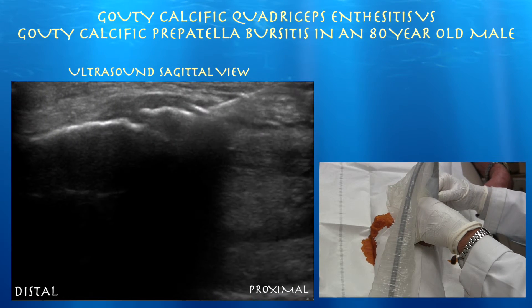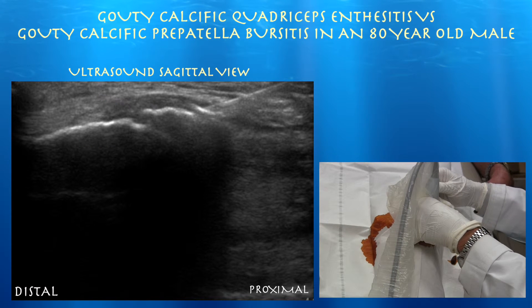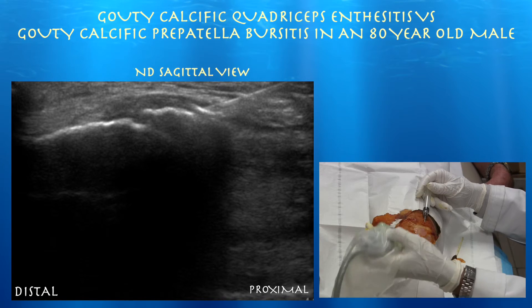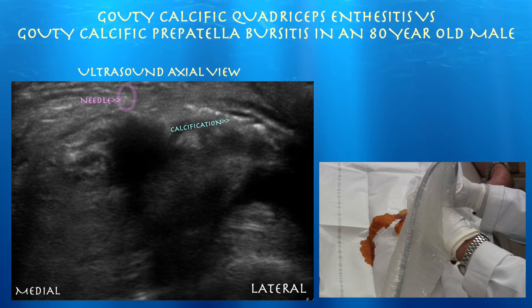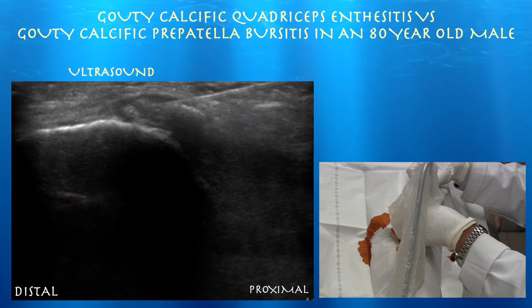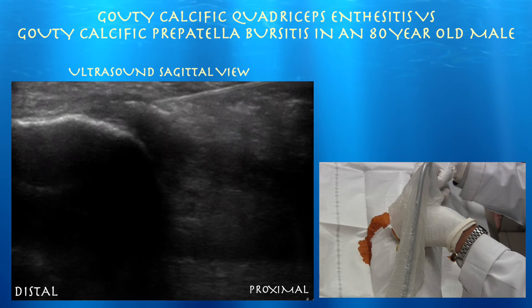It's better to do this part while the patient is numb from the lidocaine before you dilute it with saline. Going to do an axial view now to confirm needle placement.